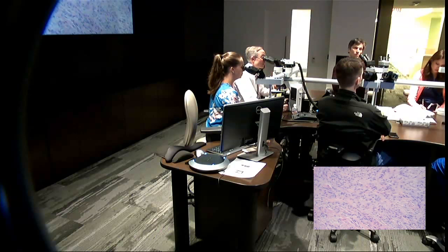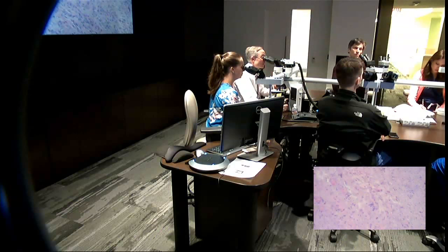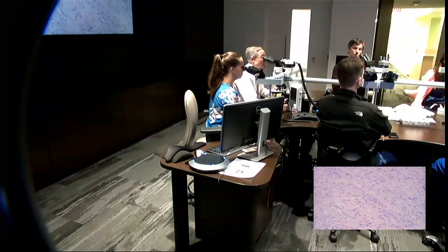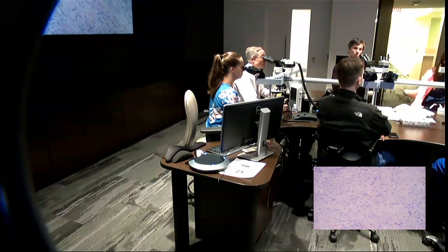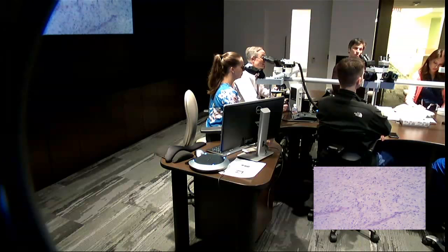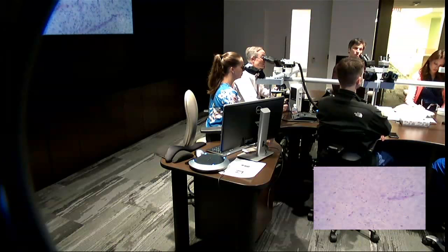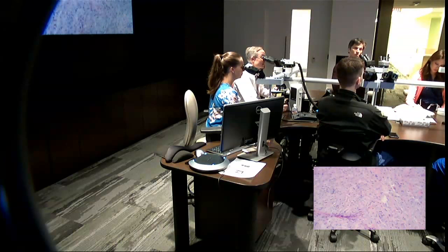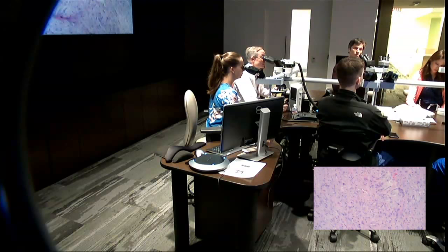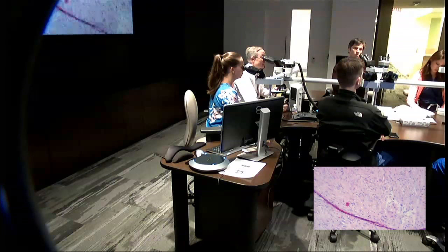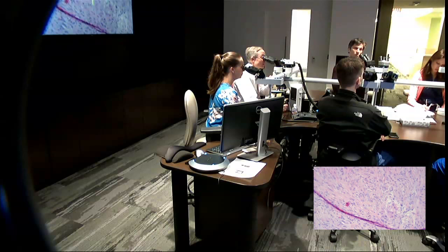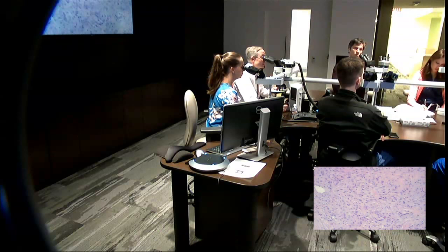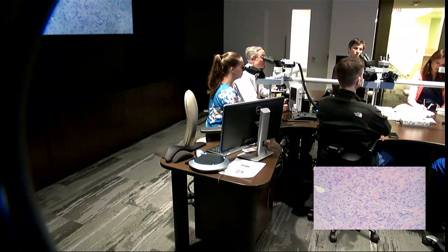It's called neurothekeoma because 'theke' means nests, and there are cells here arranged in some little nest-like aggregations. They often have a trabecular pattern with collagen bundles between the individual aggregations. Sometimes you can get mitotic figures and some atypicality — I've seen these be misdiagnosed as melanoma. There's a mitotic figure right there.